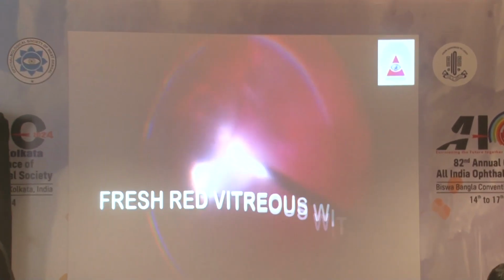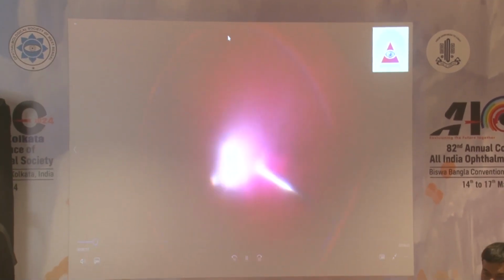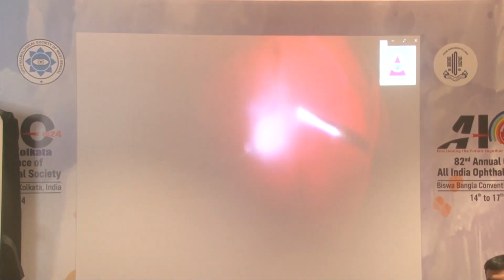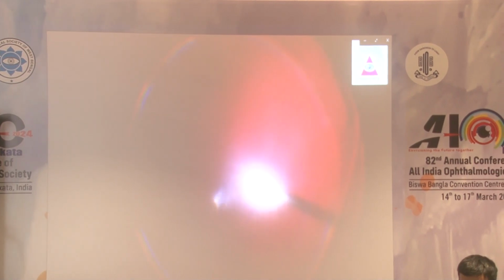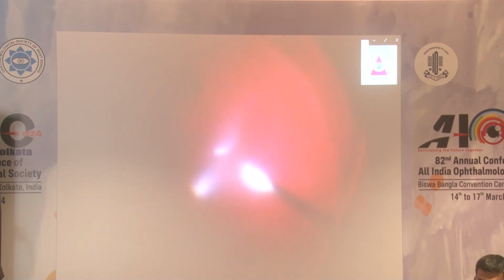Shades of vitreous. This video demonstrates various cases of vitreous hemorrhage. First case is of a fresh diabetic vitreous hemorrhage with posterior vitreous detachment. As posterior vitreous detachment is present, as soon as the vitrectomy is started and you find the plane, you can see a gush of blood coming and the vitreous hemorrhage clearing. These cases have a good post-op outcome usually as the vitreous hemorrhage is fresh and the PVD is present.